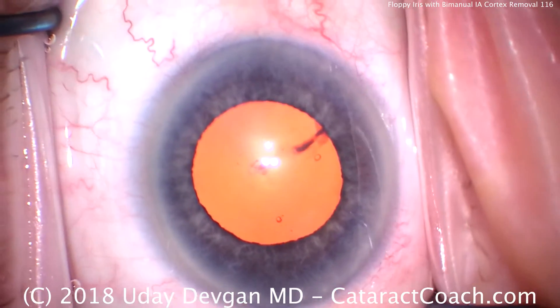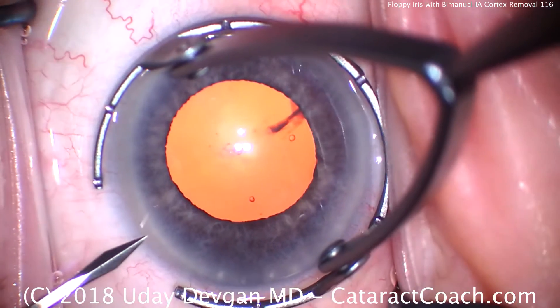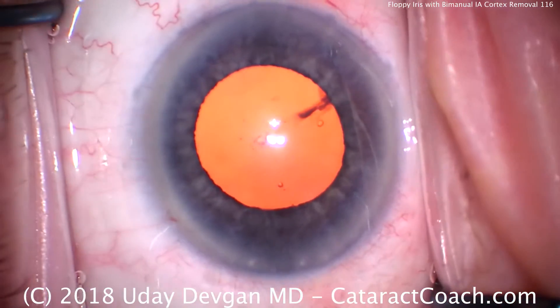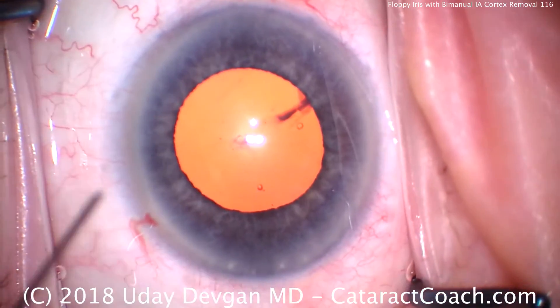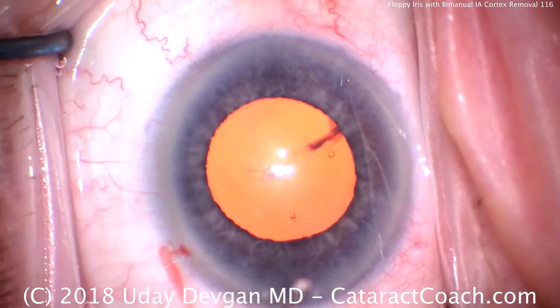Welcome to cataractcoach.com. Today's case features a patient on Flomax — another floppy iris syndrome patient. I'll show you how we chop his lens in the bag and remove it, but the pupil is going to come down during the case and we'll end up with a much smaller pupil than you see here.